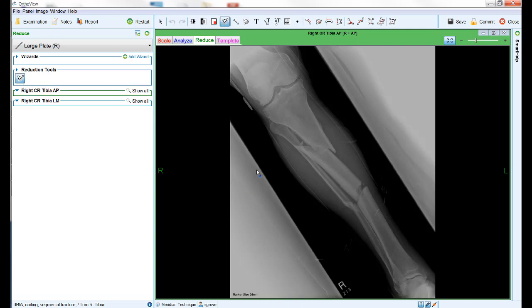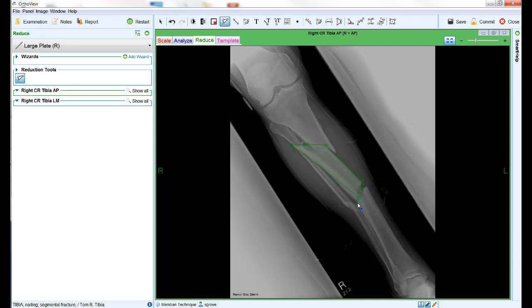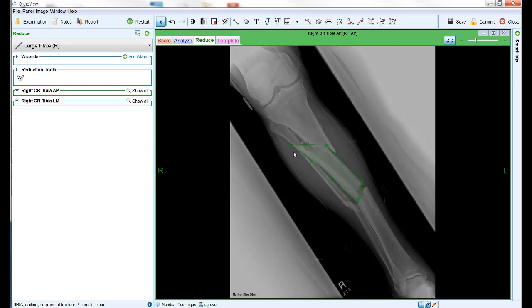Once this tool is activated, you can begin the process of outlining a bone fragment or any part of the image by left-clicking points around the required area. As you click around the image, the software will automatically close the loop. To end the tracking process, either re-click on the start point or press the escape key on the keyboard.